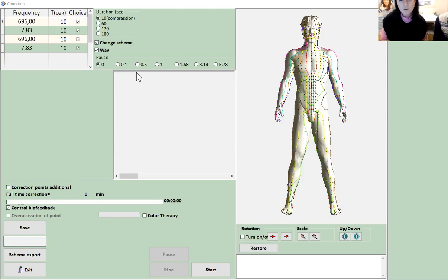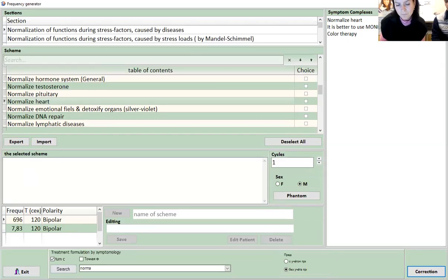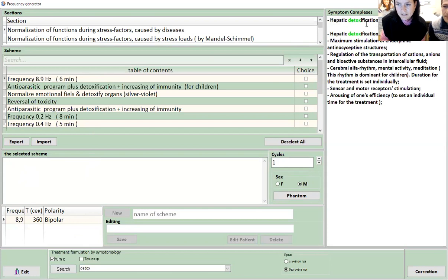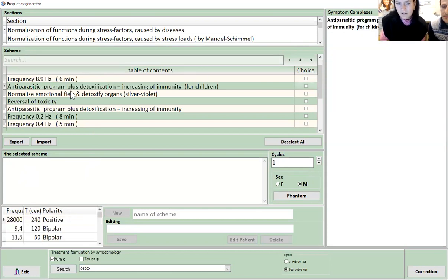You can download anything you want. For example, I start with my patients from the beginning when they come. I start by charging the detoxification of the body, because basically it doesn't matter what you treat, you have to detox the body from the beginning. So, searching for detox: here it is hepatic detoxification, antiparasitic, you can reverse, or heavy metal detox. You can download them, just don't overdo it, because if you do all the detox at the same time, patients may not feel well from the beginning.